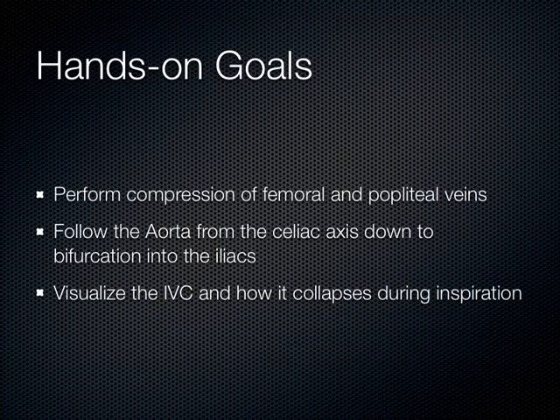Okay. So today, with the hands-on session, we're going to do compression of the femoral vein and the popliteal vein. Okay? You'll see how fast this goes today. It's going to be a pretty quick scanning session, I think, because you're just compressing the fem area, and then you go down to the pop, and then you're going to follow the aorta down until it bifurcates, and then I want you to look at the IVC and how it collapses during inspiration.